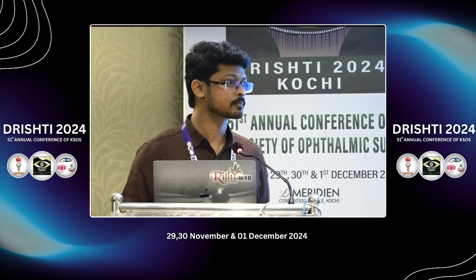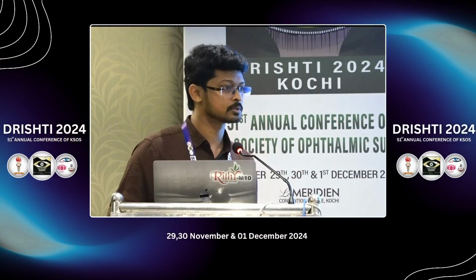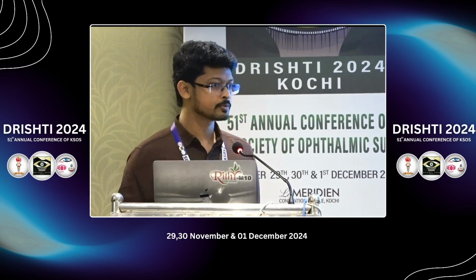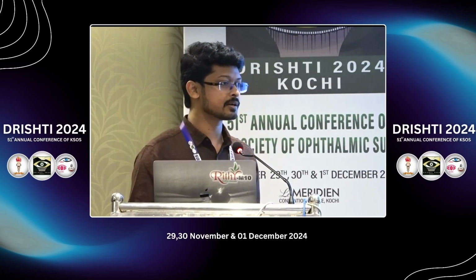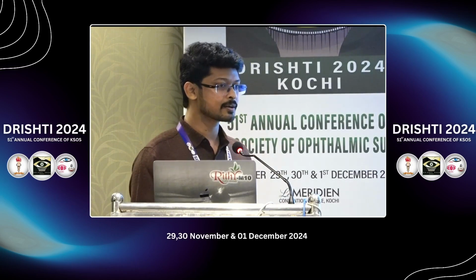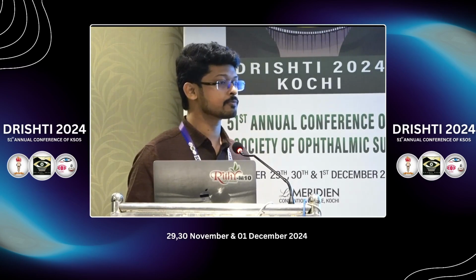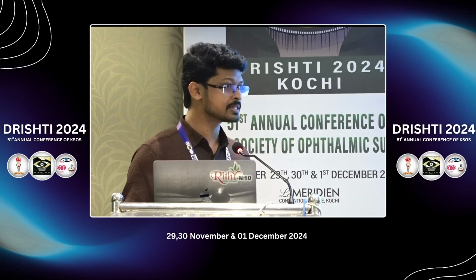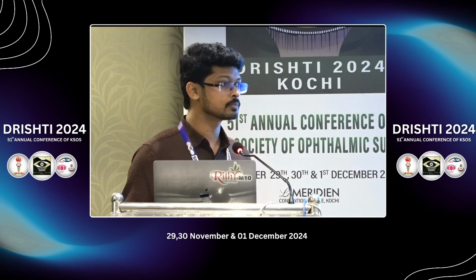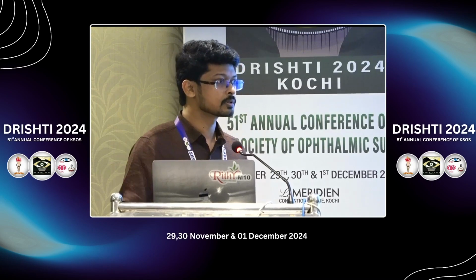It was a good study, first time we are seeing this in uveitis, I think. Is it practically possible? Yes, madam. Because it's non-invasive, we are not using a dye. Multiple FFA or ICGA episodes we could avoid, and also if there is a financial constraint, we can use it for multiple imaging, mainly for follow-up. Okay. But follow-up means again every time you have to keep on doing, right? Will that not be a burden for the patient?